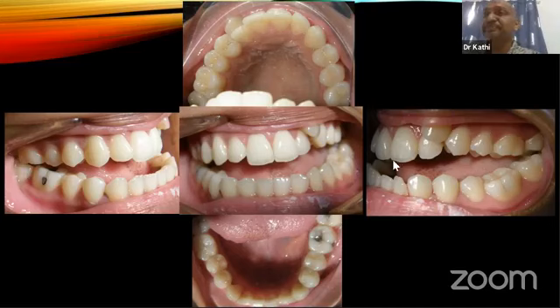He has a transverse discrepancy where the centerlines are also not coinciding. The cephalometric analysis clearly shows he has an ANB of negative 0.7, Wits of negative 8.4, which is a class 3 skeletal problem, with an open bite and proclined upper and lower incisors.